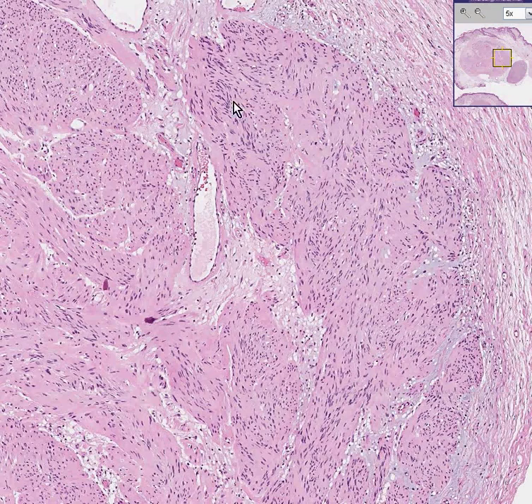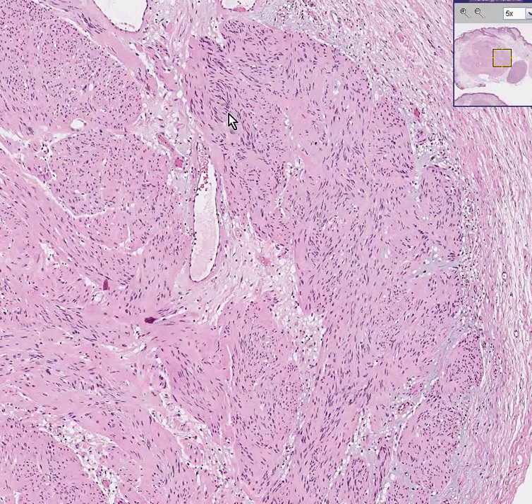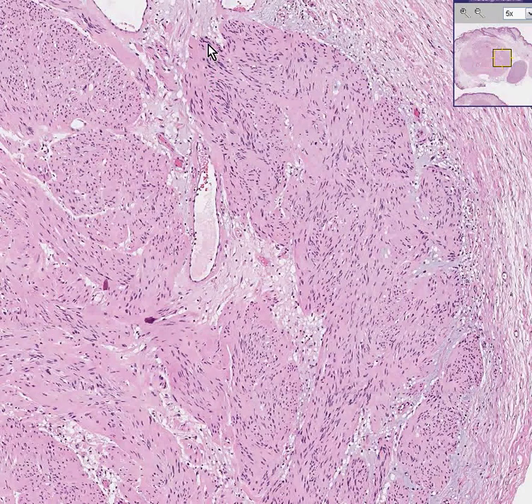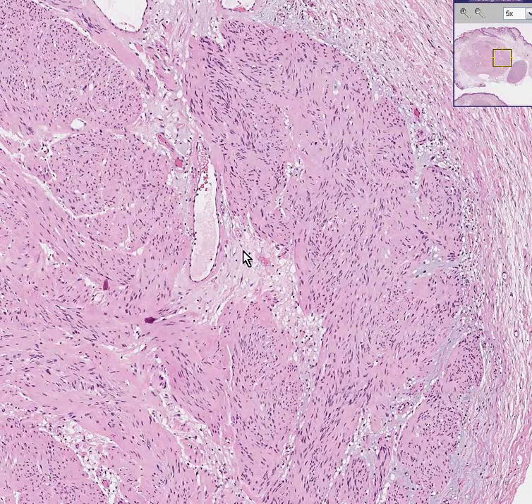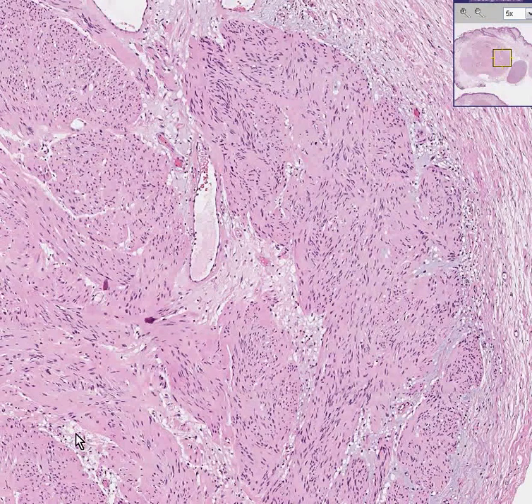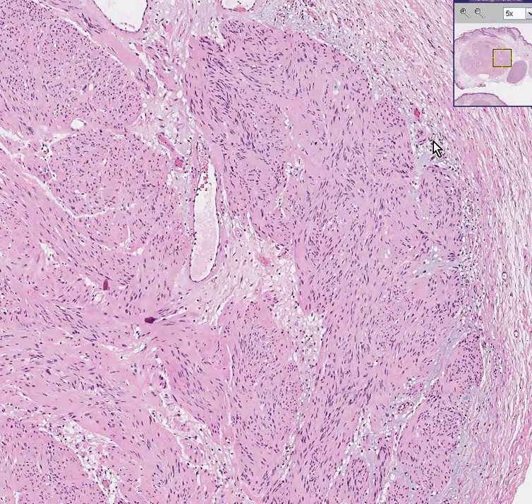The Antoni A areas are areas in which the neural spindly cells stand up in a palisaded fashion, and you're getting kind of an appreciation for that along here. The Antoni B areas are areas where the tumor cells perhaps have a lot of edema or much looser type of connective tissue, like here, like here, and like here.